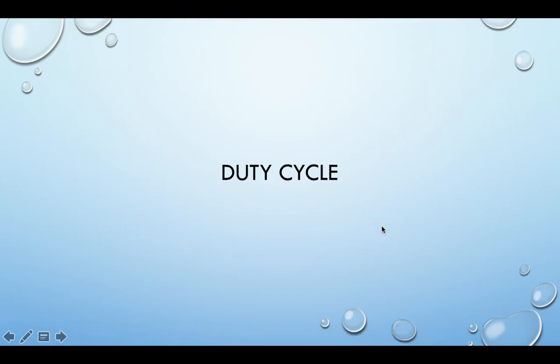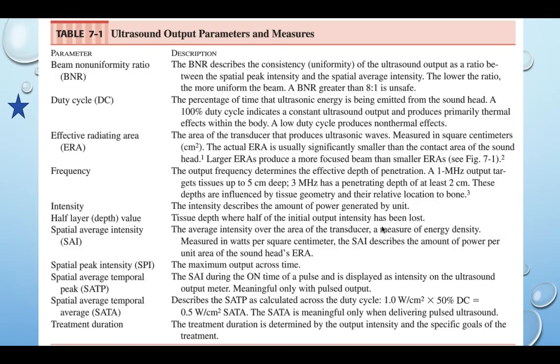Okay, next term, duty cycle. So the duty cycle, just like when we had for eStim, right? It was the on and off time. So we were able to manipulate that for our muscle re-ed and have the time that the wave was on and then the time that the wave was off. We can do the same thing with ultrasound for a different reason in this case.